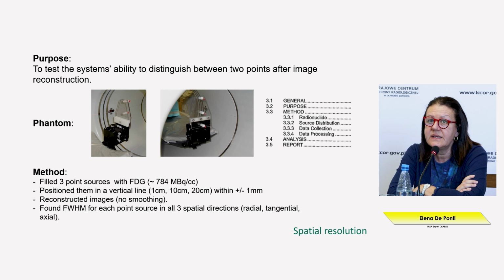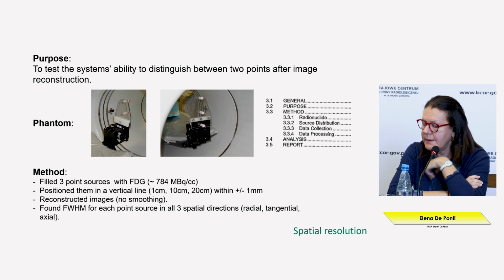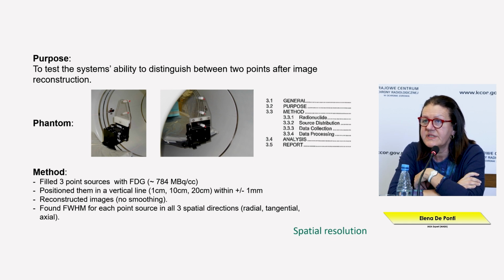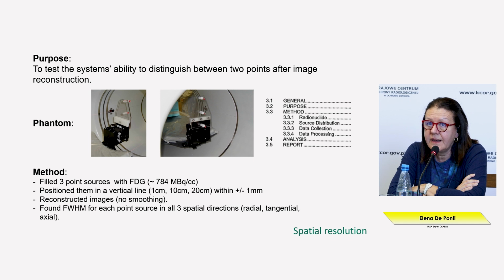That means that all the phantoms and the tools that are needed to perform a test in the correct way are described, and if you have an alternative, all the options are described. And then we have also a precise description of the setting of the phantoms to get the correct acquisition, and also a precise description of the analyzing phase, so how to analyze the results.